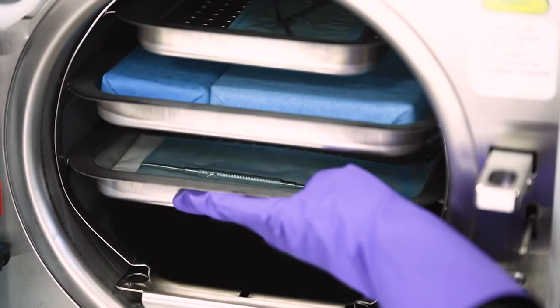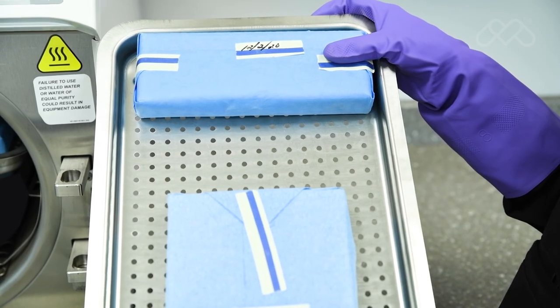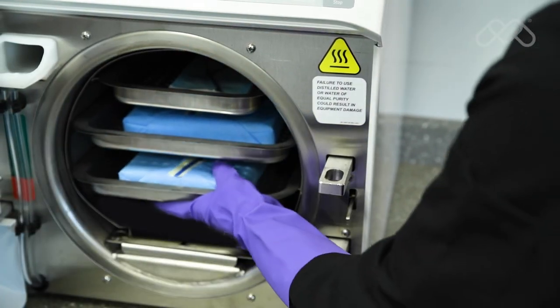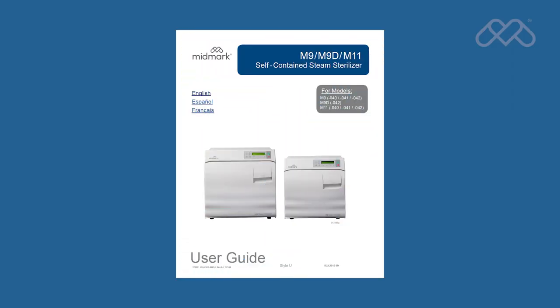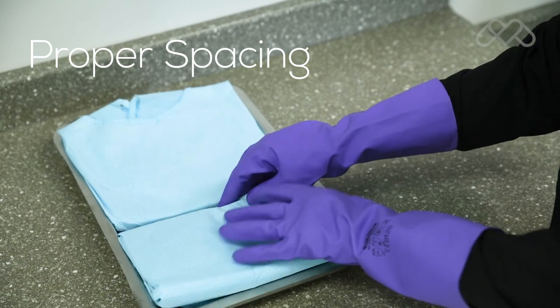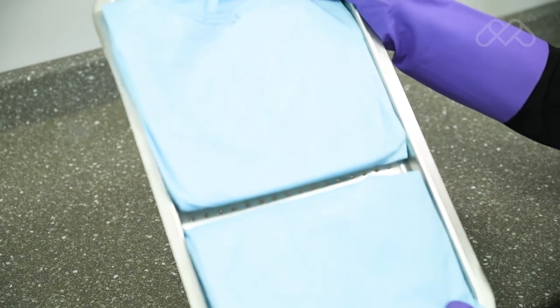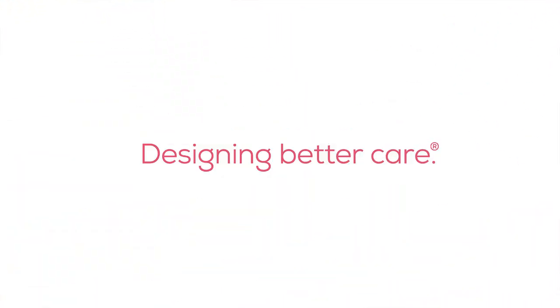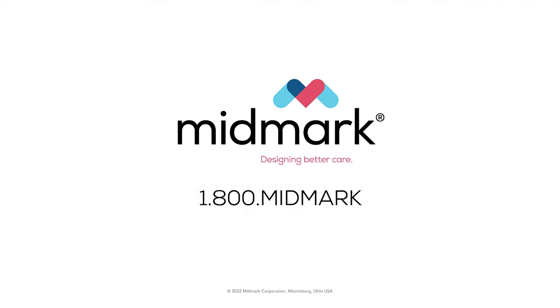Successful sterilization is dependent upon correct loading of the sterilizer. Do not overload the sterilizer chamber. Adequate space must be maintained around all items placed in the chamber to assure proper steam circulation and adequate drying. The maximum capacities tables in the user guide are provided as a reference regarding the maximum loads that can be processed in the sterilizers, but maintaining proper spacing between all items processed to assure good steam circulation and drying should be the guiding factor in determining the maximum load. For more detailed information about your sterilizer, please refer to the M9-M11 user guide. For further support, contact Midmark Support Services at 1-800-MIDMARK.